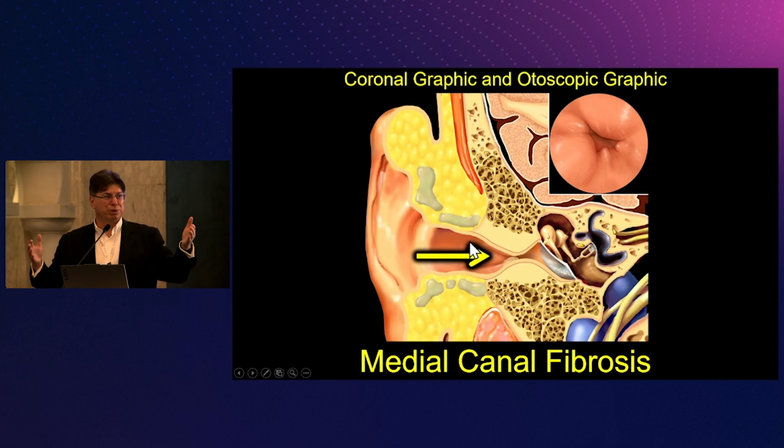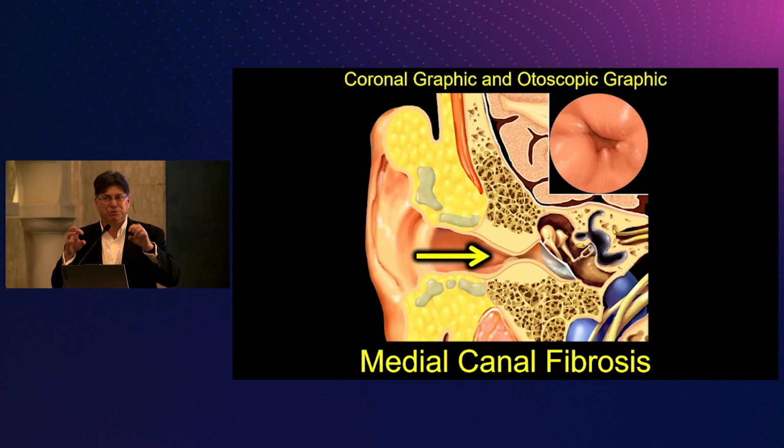That's very important when we think about temporal bone as well as skull base. The words we use to describe the osseous changes. Is it permeative destructive? Is it expansile? Is it sclerotic? Is it increased density? So we need to be very careful about those words we use, because sometimes as soon as you use one of those words, especially at the jugular foramen, you're going in this direction. You're thinking about that pathology. And you may start to apply imaging findings that are not there to that study itself.